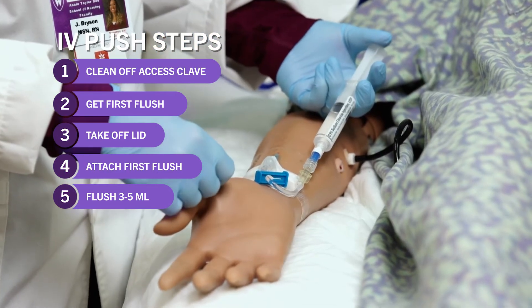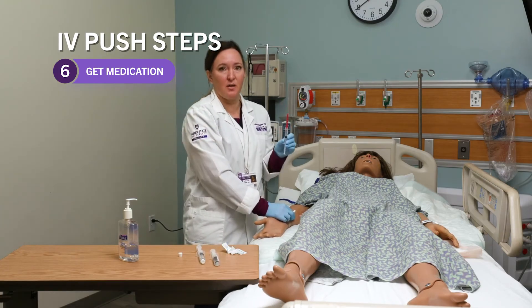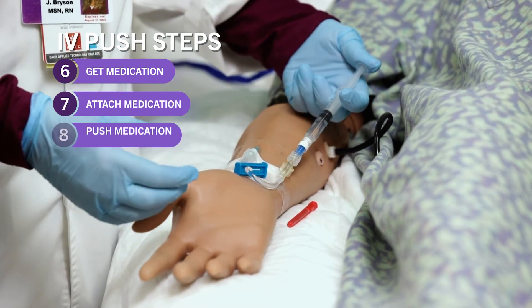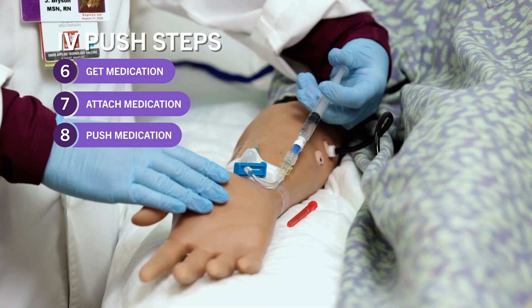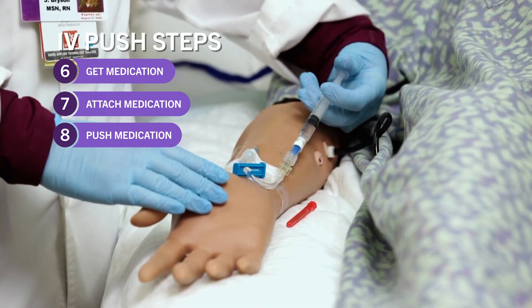Then get your medication, which you have previously drawn up in the correct size syringe for the dose. In the same manner, not touching the ends, attach your medication. Push your medication according to the instructions you looked up in the drug guide. If it says to push it over two minutes, push it over two minutes.